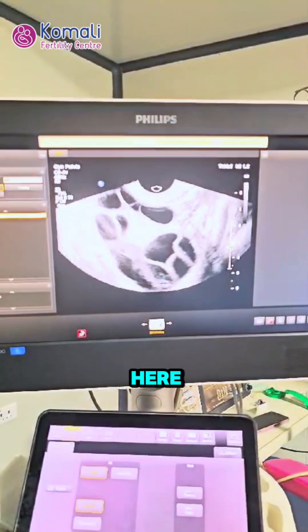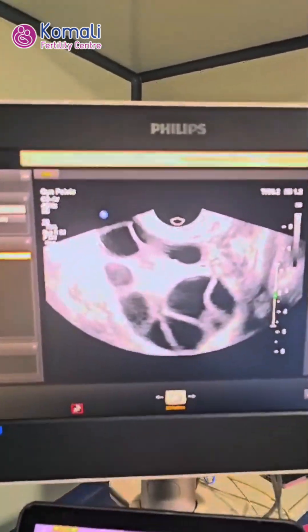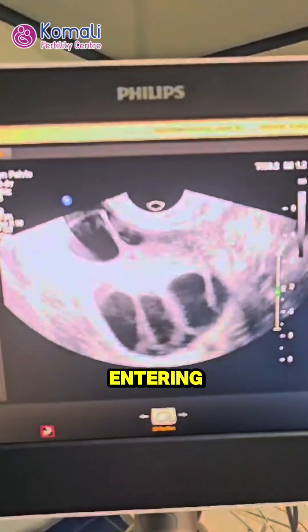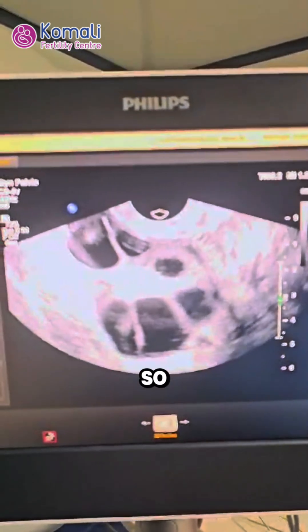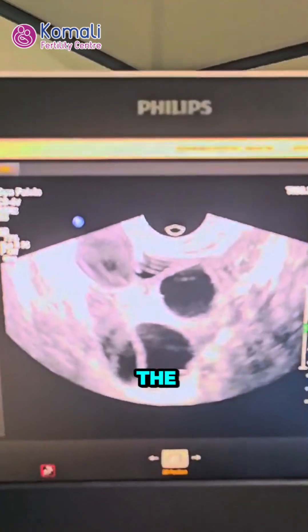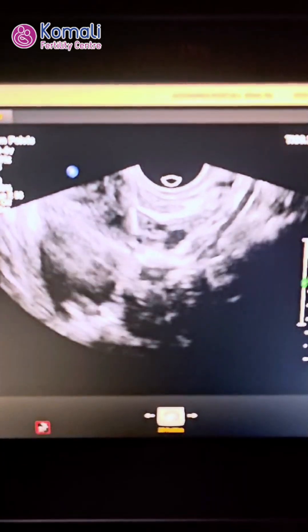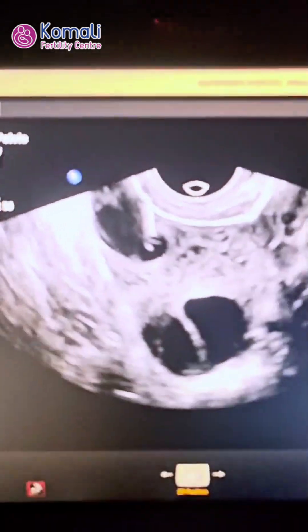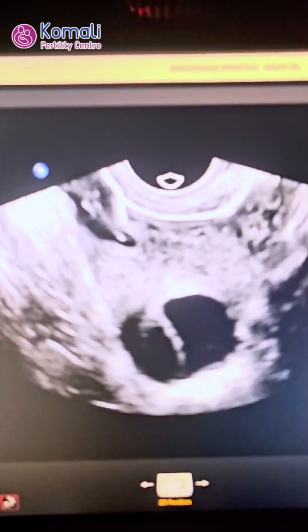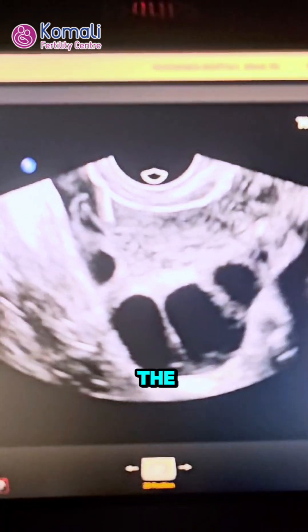Now we can see the follicles here. This is a right ovary overview, so I will be starting the procedure. For ultrasound guidance, my needle will be entering into the ovary. You can gently observe here as I enter into the follicle. The follicle is getting collapsed here as I aspirate the follicles.